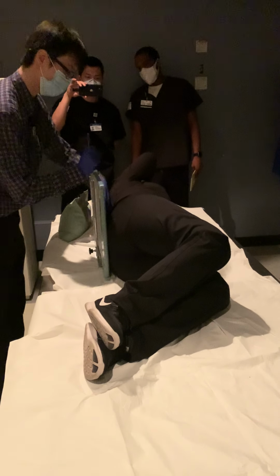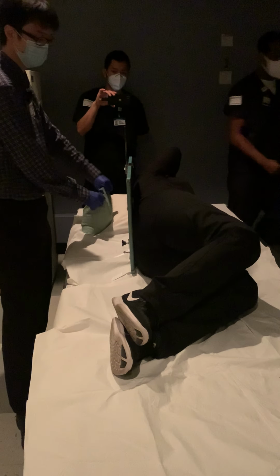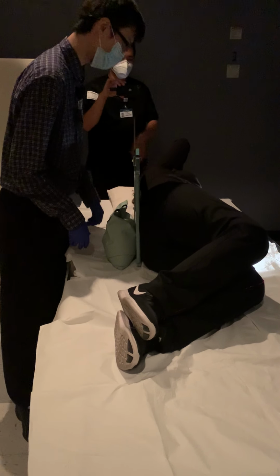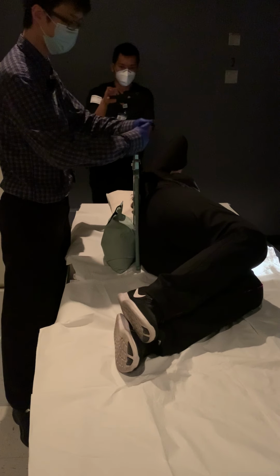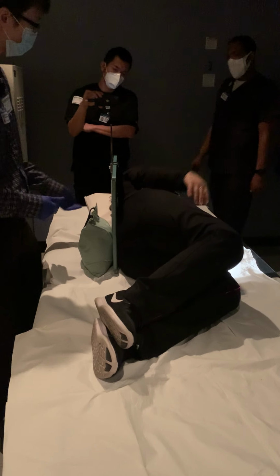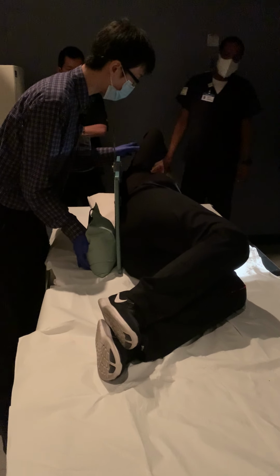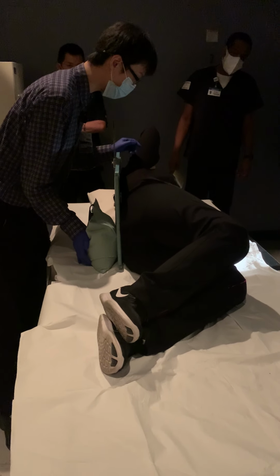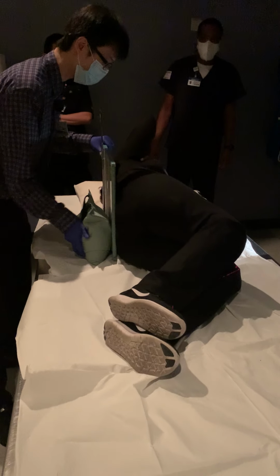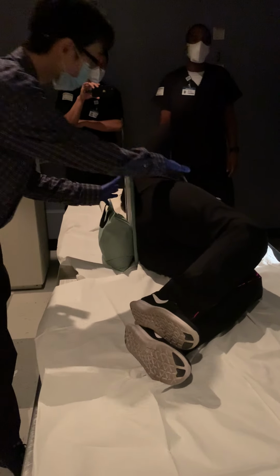So, take this, shove it all the way up against the patient. Right? Minimize that OID. Okay. Looking at it, the board looks a little bit crooked here. So, I think the patient's MCP is also just a tiny bit off in that case. So, Wani, from here, all I want you to do, hold your shoulders still, but move your hips forward slightly. Good. There we go. Now our board is straight.